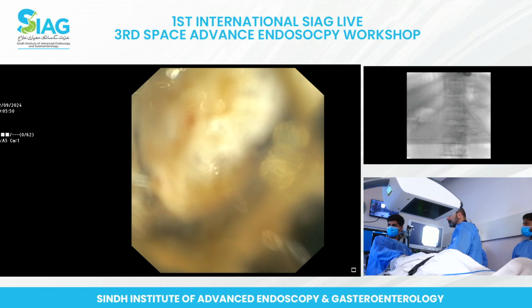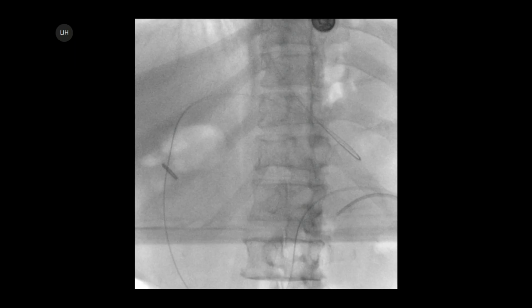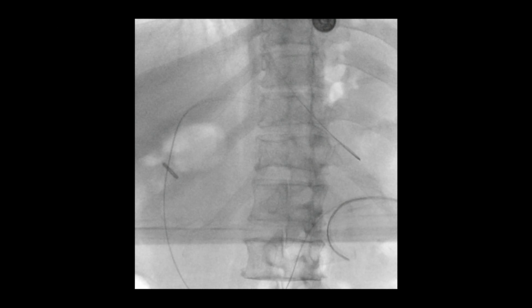Wait, what is the advantage of putting a biliary drain versus what you're doing? So it's a larger lumen, and so it's much faster filling of the jejunum. And secondly, you can do this whole process endoscopically under direct visualization. Then you just put the nasobiliary and pull out the scope, so you're good to go. It works really well actually.